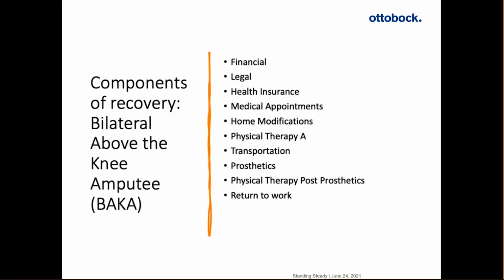It was kind of a shock to me initially, trying to take that first step, if you recall, toe load to initiate the swing of the C-Leg 2. And I couldn't get that magic pop or rollover to happen. We spent several hours and several sessions just trying to get me to be able to trigger that knee. And once I ultimately triggered it, having my brain switch gears from my right leg to the left leg.